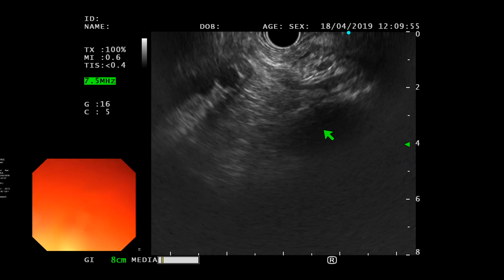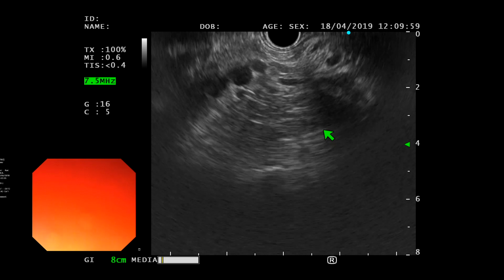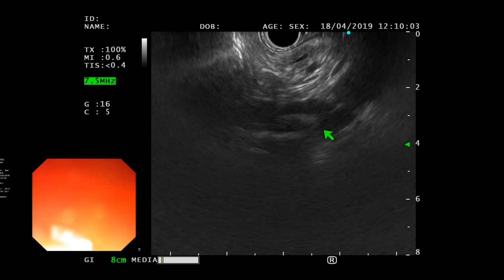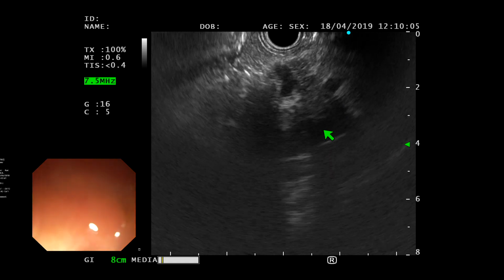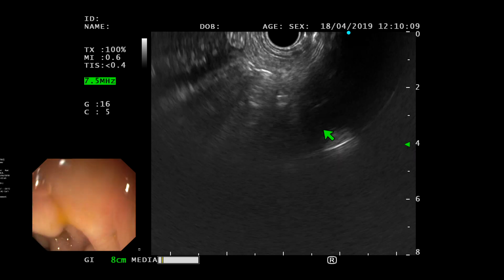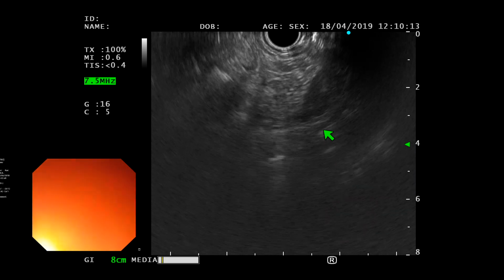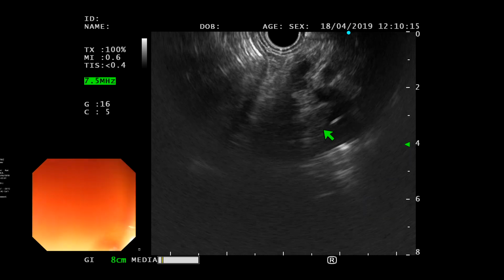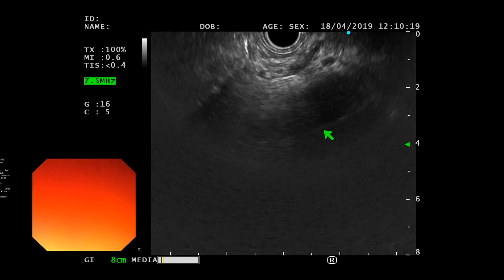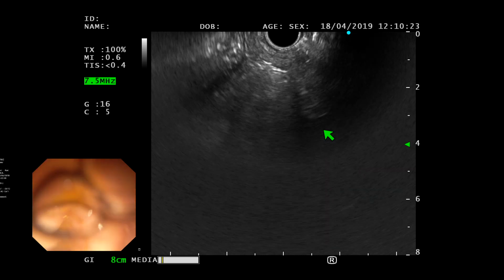It's not very obvious to me, but we should see the bile duct, and you've gone back to the left. So go. There you go. Keep going counterclockwise. Okay, here now advance the scope a tiny bit. Thumb towards you, and go clockwise. And there you will sometimes see the duct go down this way. But I think that's the best you're getting from this area right now. Okay, but oh, there it is.